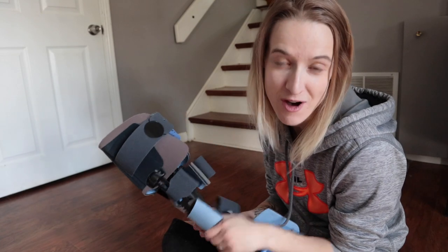Hey everybody, it's Joe. Welcome back. So this will be a quick video, but I wanted to take a moment to show you what they gave me when my cast came off two weeks after surgery.